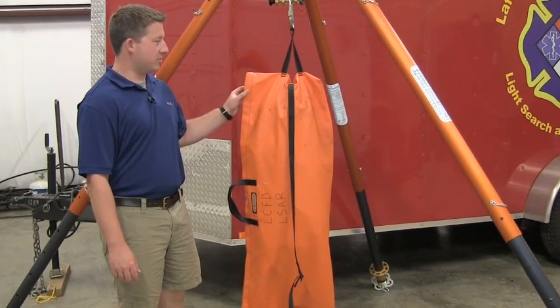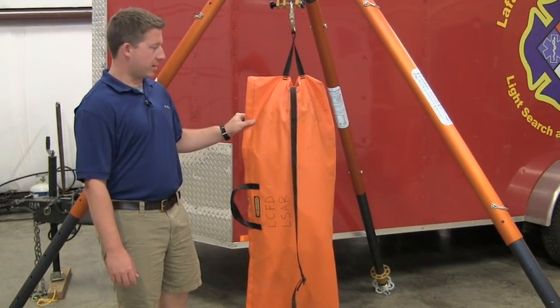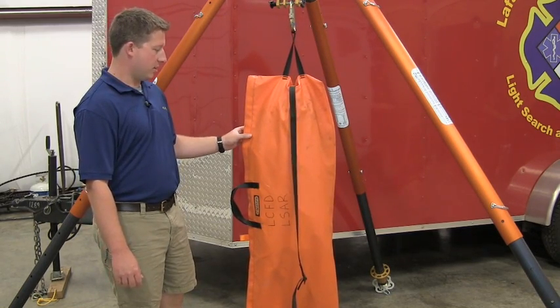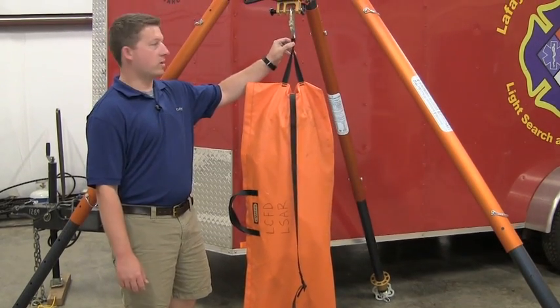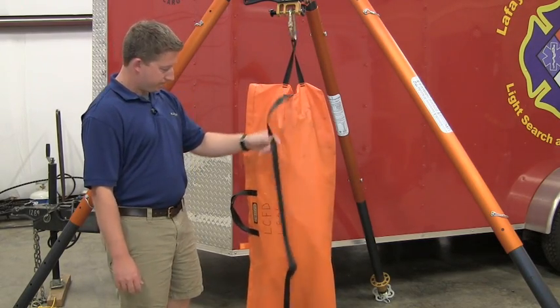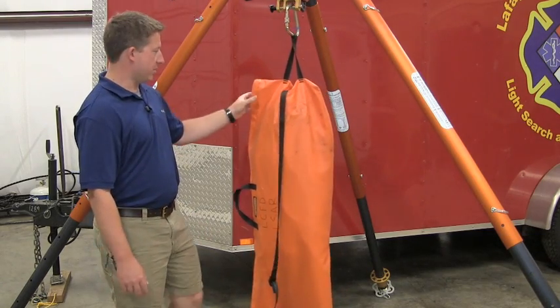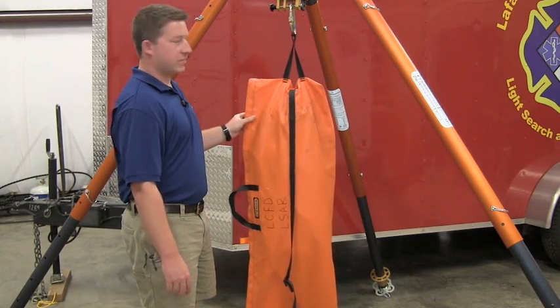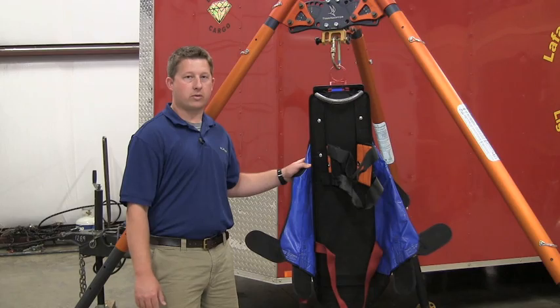Okay, the Yates Spec Pak comes inside of a carrying bag. Inside this bag is the bridle for the Spec Pak and the Spec Pak itself. It also comes with a C-collar, and you can keep your own C-collar inside the bag. The bag has a hanging strap we use to keep it stored and hang it inside of our trailer. It also has an adjustable carrying strap, some handles to carry it with, and a zipper along one side. It's heavy-duty rubber, so it's pretty weather resistant, and it weighs about 20 pounds. The Yates Spec Pak is a Class 3 harness with a maximum capacity of 310 pounds.